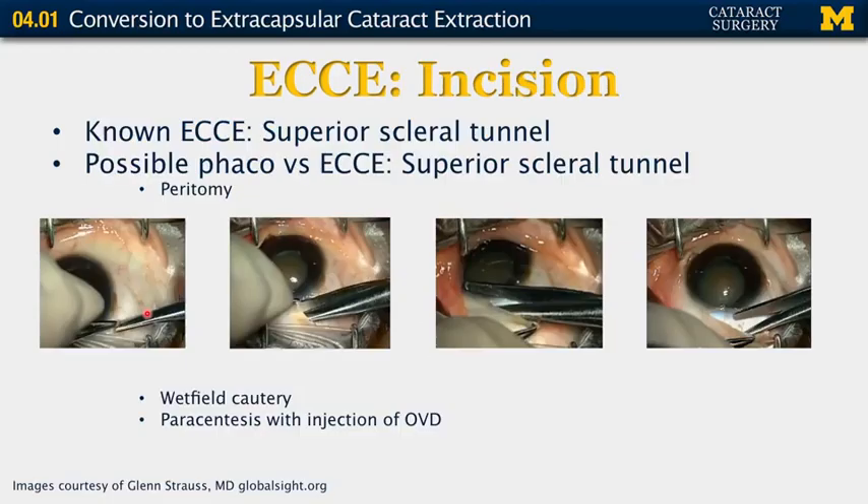We're going to start with the incision. If you know you'll be performing extracapsular cataract extraction, you will often prefer to do a superior scleral tunnel. To do so, you need to do a peritomy. You use tooth forceps and Westcott scissors to make a little snip in the conjunctiva, separate it from the underlying sclera, and snip along the length of the limbus — usually about 11 millimeters. Once the adhesions are removed, perform wet-field cautery, create a paracentesis supertemporally or supranasally depending on handedness, and inject some viscoelastic material.